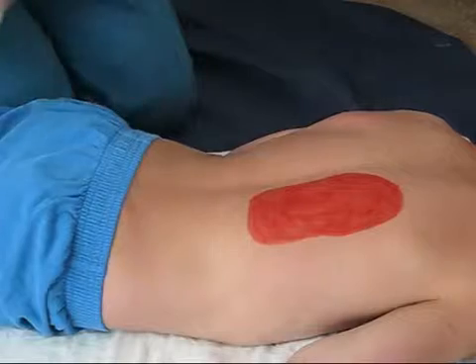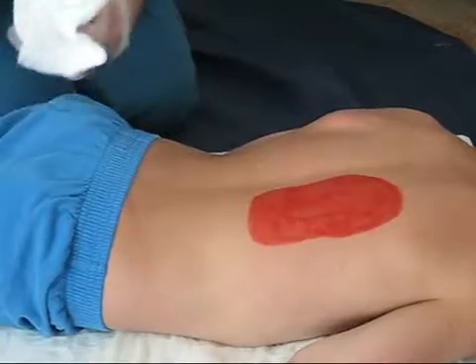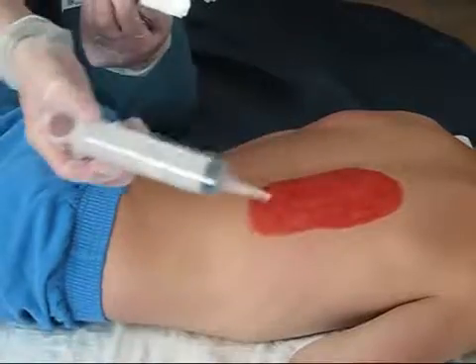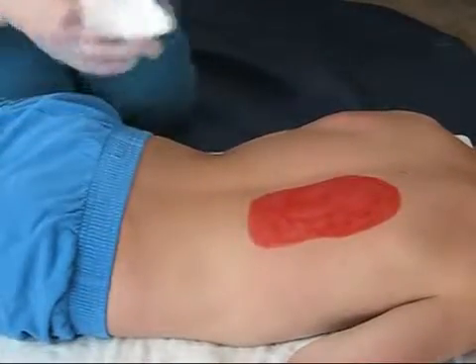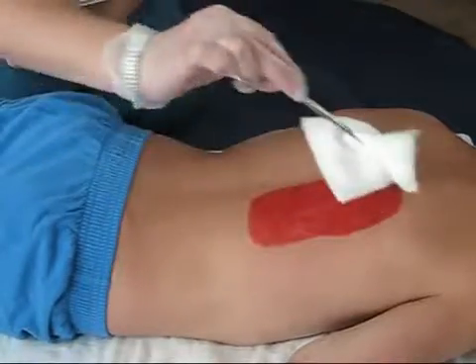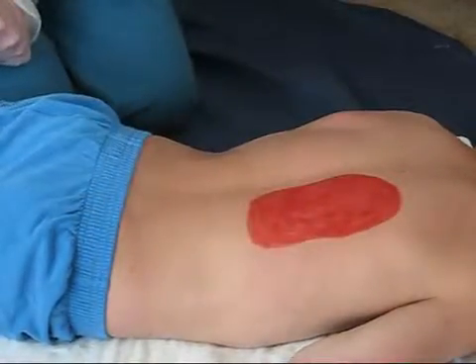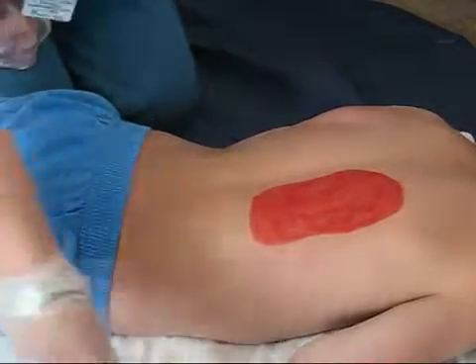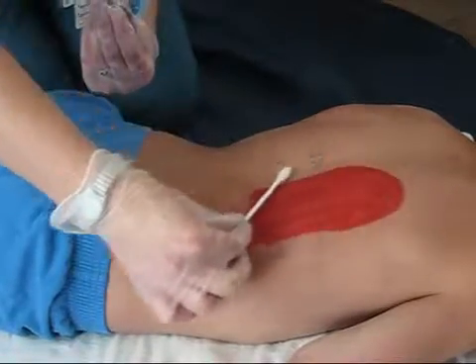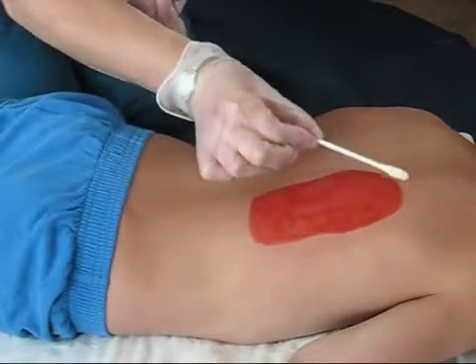Then you want to take your normal saline, or check the doctor's orders for what he would like the wound irrigated with, and make sure you irrigate the wound, first the inside, and then you can take gauze and just dry it out, making sure that there's no residue left from any previous dressings, and clearing the outside also. Next, you can take your skin prep, and this will help the drape stick to the skin site. Make sure that you get all around the wound.